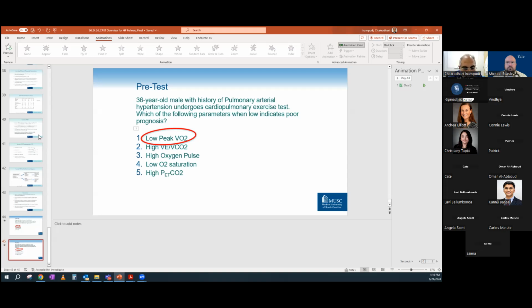I would say, we have about 1,000 heart failure admissions to our health system on a yearly basis. And we tend to perform CPETs on a regular basis for all patients who are coming to our heart failure clinic, whether it's a heart failure reduced EF or for heart failure preserved EF also, because there is data now to show that a low peak VO2 in heart failure preserved EF is also indicative of RV, PA uncoupling, and also pulmonary hypertension in these patients, which we know is a poor prognostic marker in HFpEF patients also. So we tend to do CPETs on a regular basis for them.